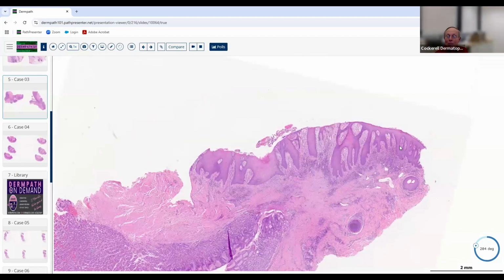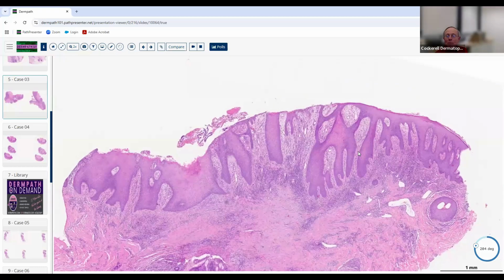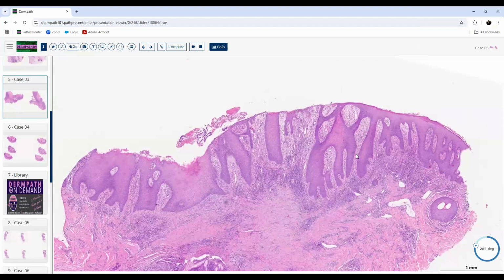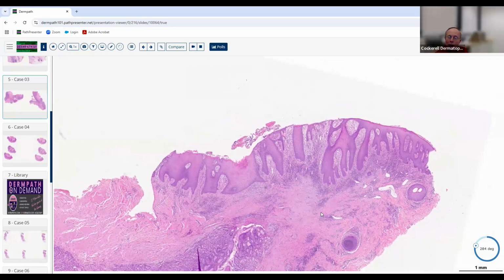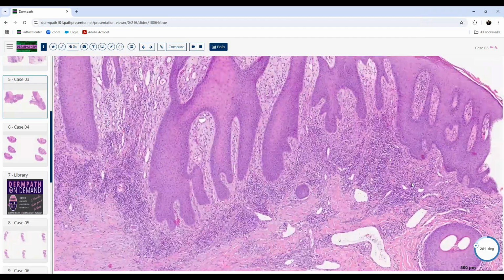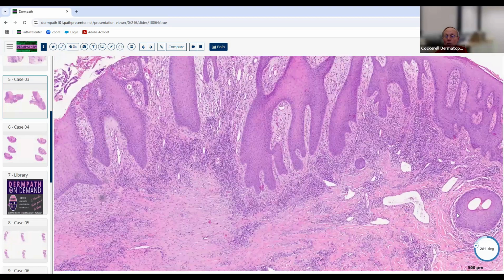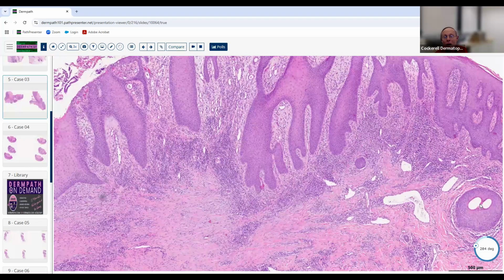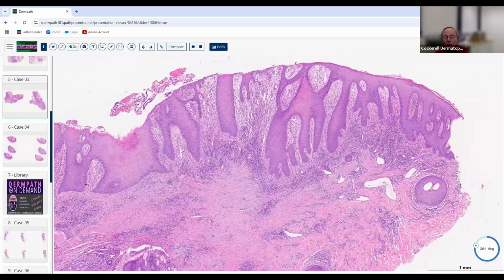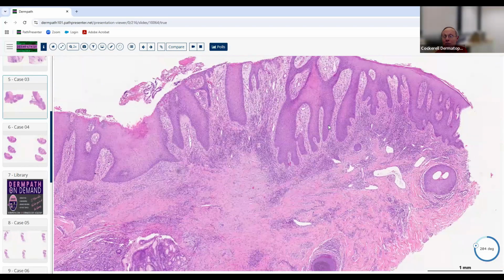Okay, what about this area? The top. I think that is like skin. Yeah, good. That is like epithelial, like skin epithelium. Can you tell which part of the body you're on? Maybe mucosa, because the top layer is very thin. Well, we do have a stratum corneum though, don't we? And a granular cell layer. Okay. I mean, it's possible to be kind of near a mucosal surface, and here's also a hair follicle. So it wouldn't be a mucosal surface itself, right? Might be near one.